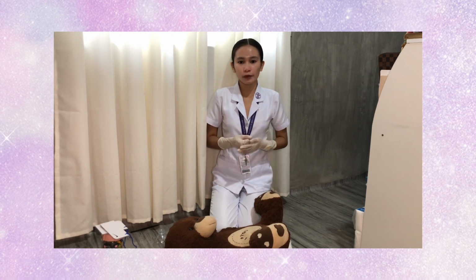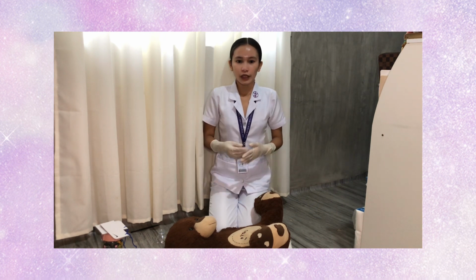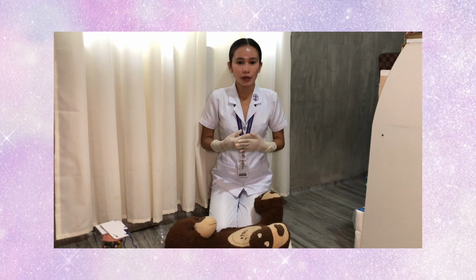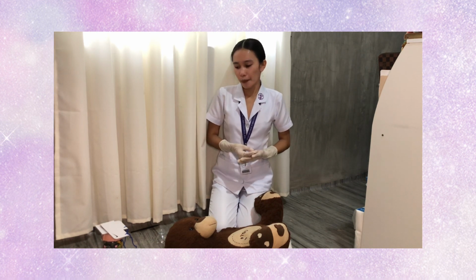Now I'm going to perform the AED skills, and let's assume that the AED arrives, and I am the second responder. So now I am going to turn on the AED. The AED, also known as the automated external defibrillator, analyzes the heart rhythm and if necessary administers an electric shock to help the heart re-establish an effective rhythm. So now I am going to place the pads.